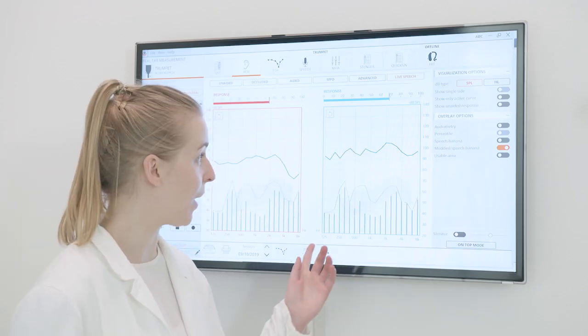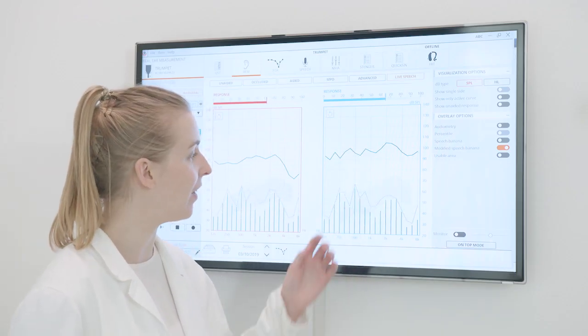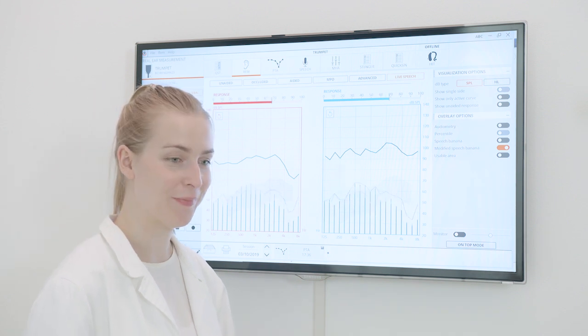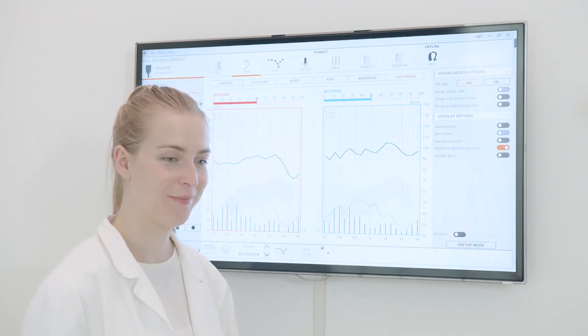whereas the falling curve follows the speech banana profile and stays inside its upper half. Before running the peaks mode, proceed with the acquisition of a pure tone audiometry and the UCL curve.